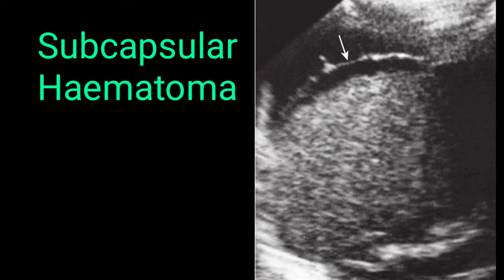The importance of ultrasound in accident and emergency cannot be denied — it is the easiest way to detect intra-abdominal bleeding or rupture of any organ. On this image you can appreciate subcapsular hematoma of the spleen. The splenic parenchyma appears heterogeneous, and you can see a crescent-shaped hyperechoic line with an anechoic lesion underneath indicated by the white arrow — this is the subcapsular hematoma.